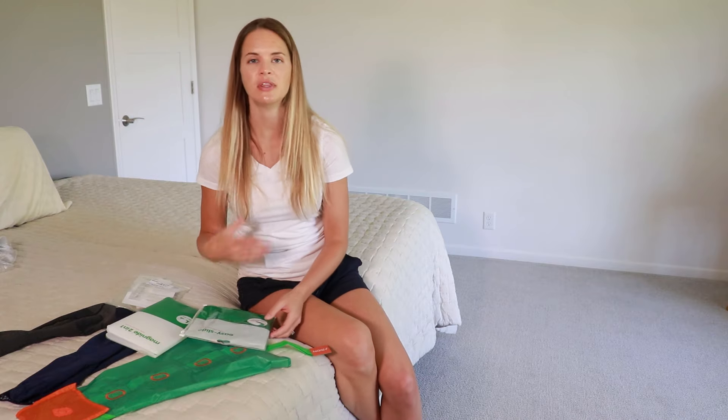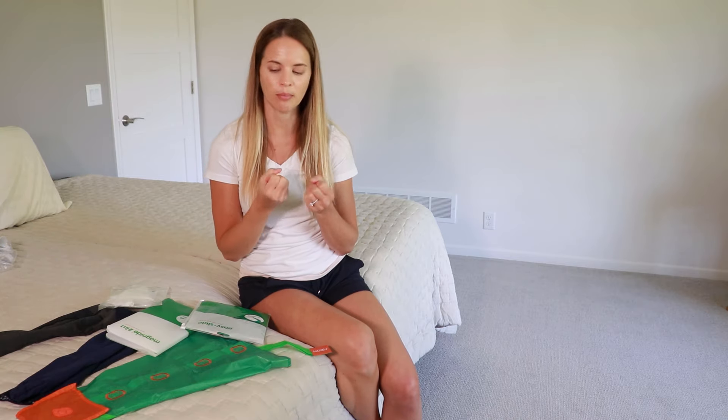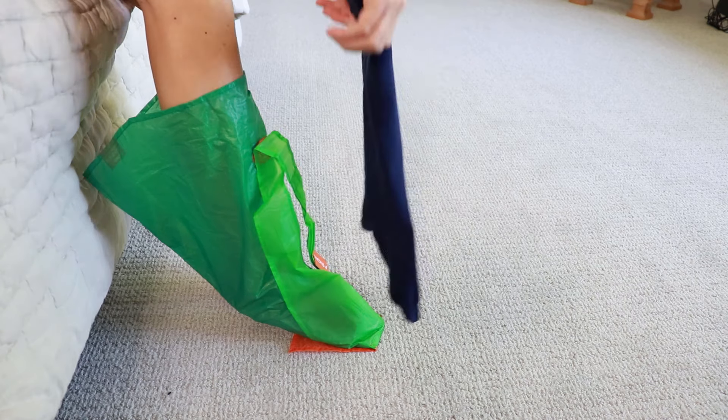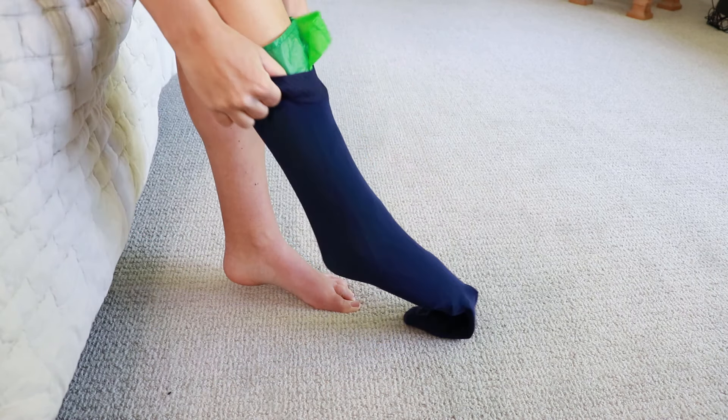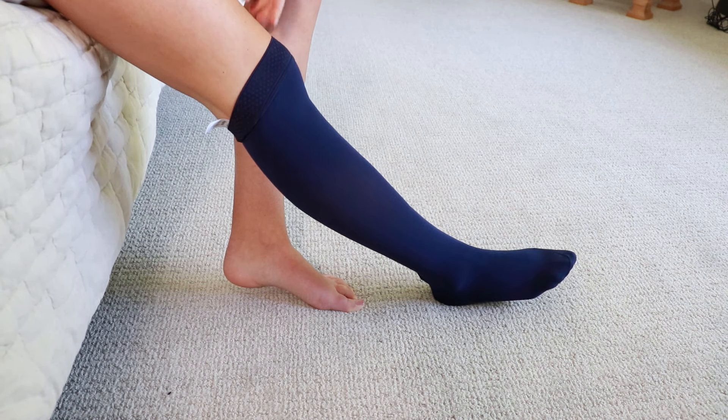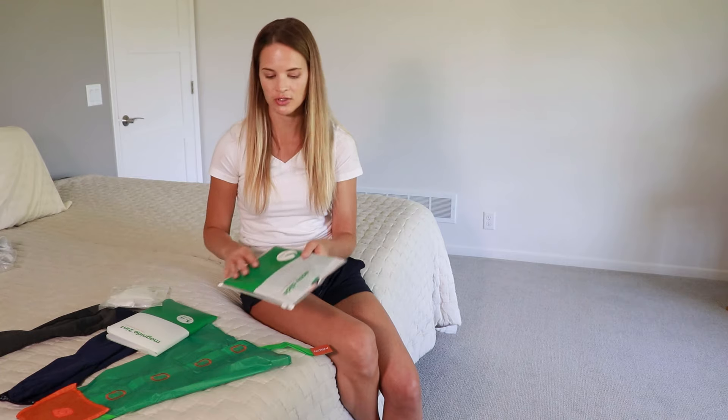Other options are the easy slides, which are green or clear slides. For those who can pull up the garment but have trouble with the heel area, or whose skin is sticky from lotion or humidity making the stocking hard to slide up, these have a slick surface so the stocking will slide right up. Pull the stocking over the slide, then pull the slide out and the stocking will stay put. They come in options for the arm and the leg, as well as open-toed and closed-toed versions, so make sure you choose the right one for your needs.